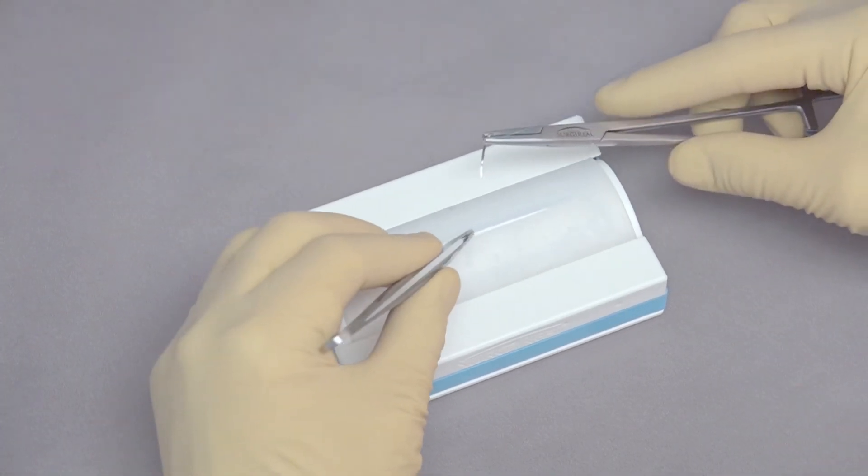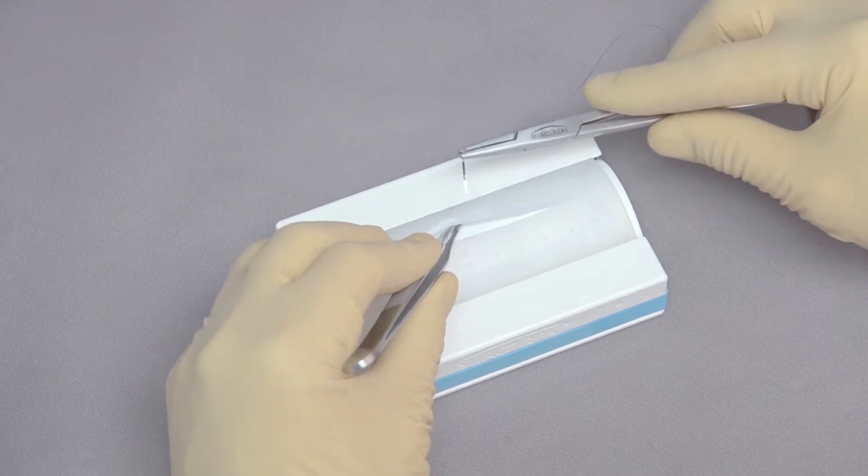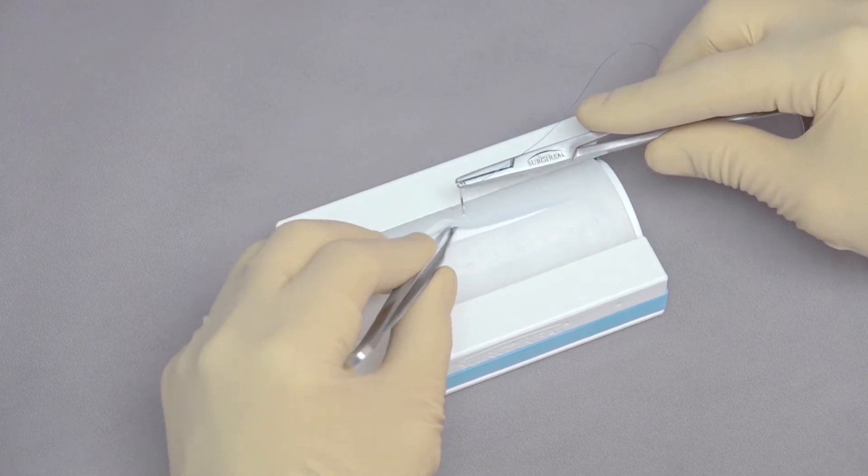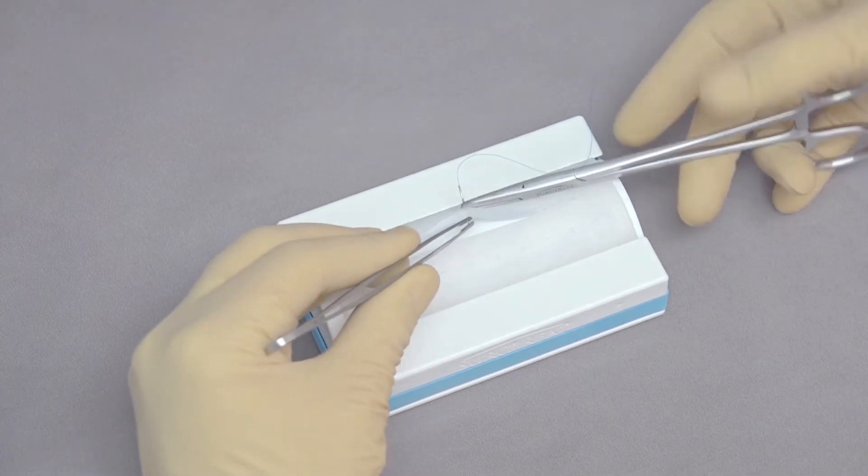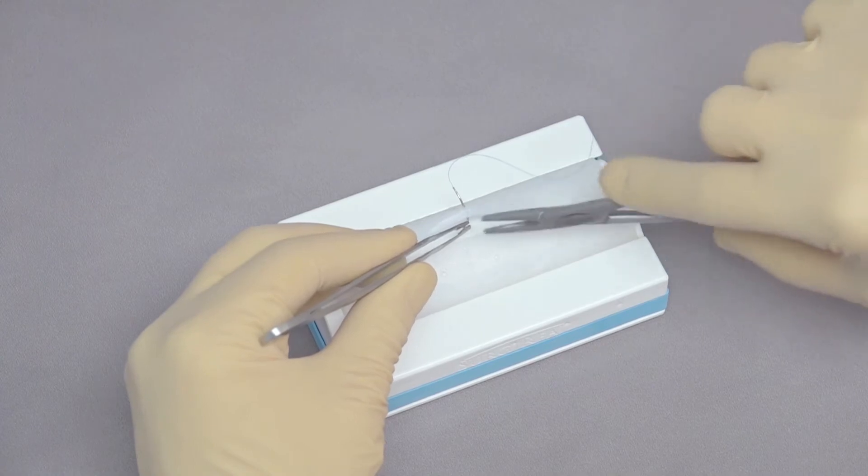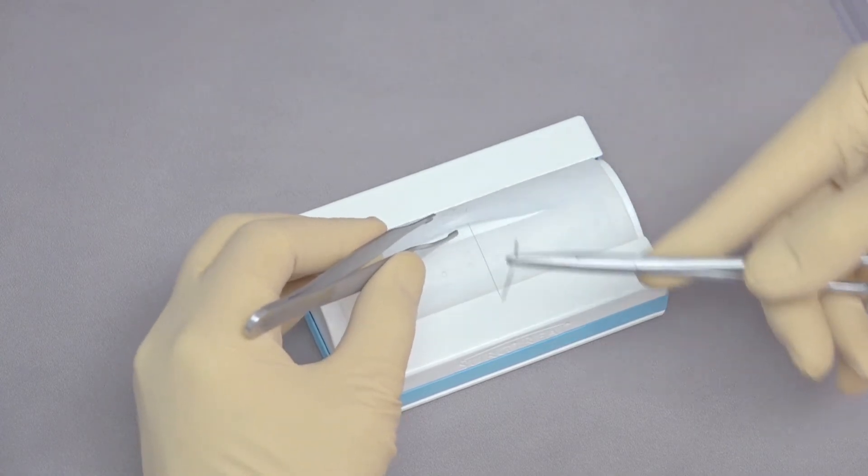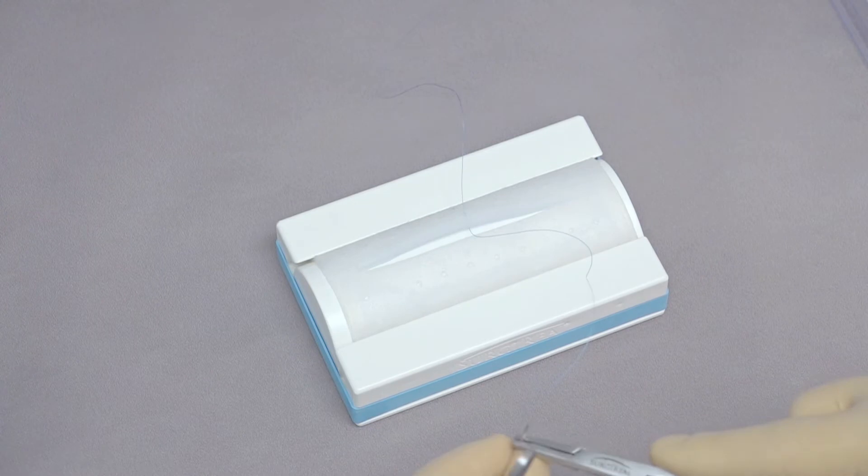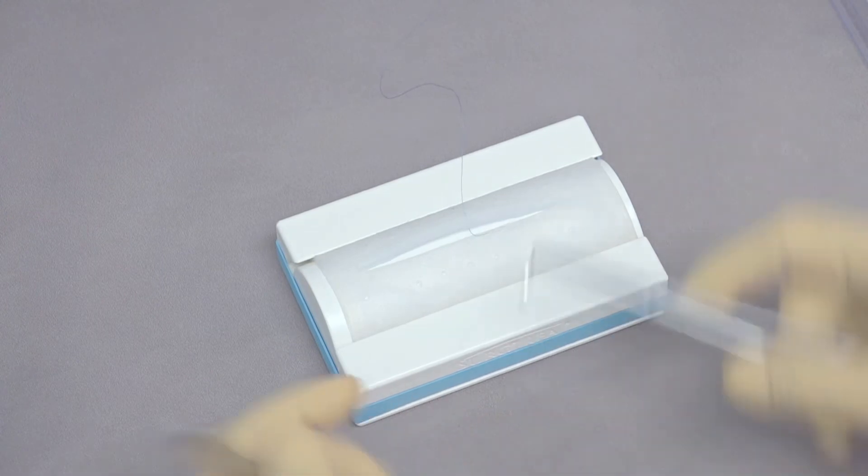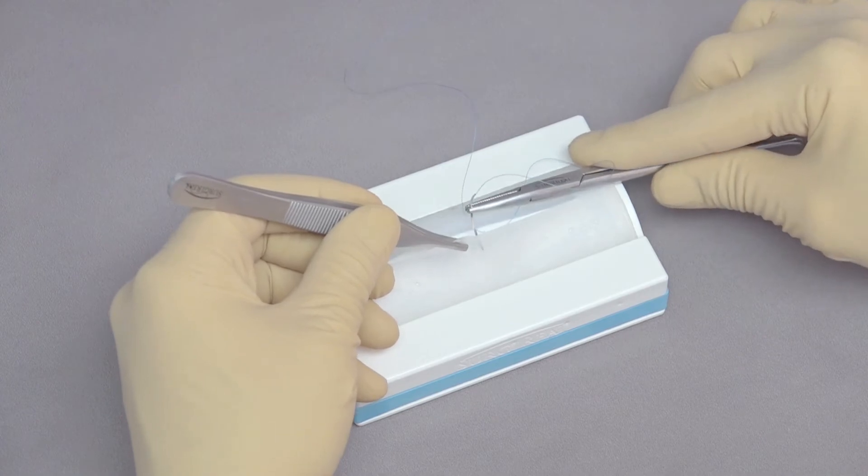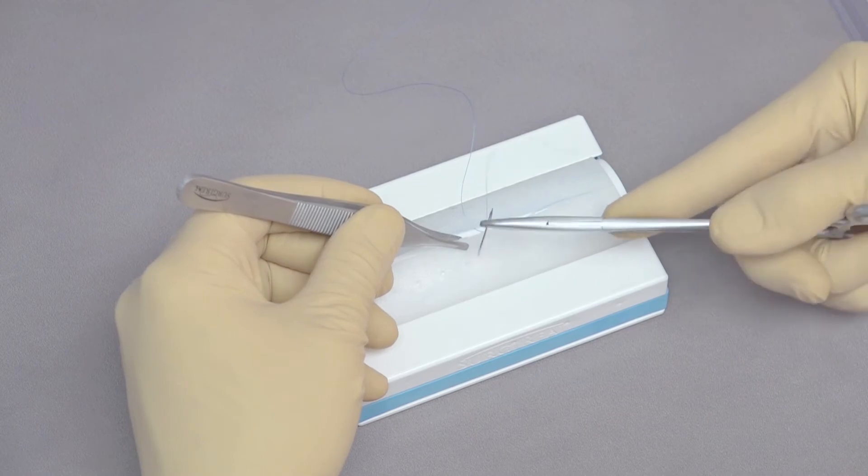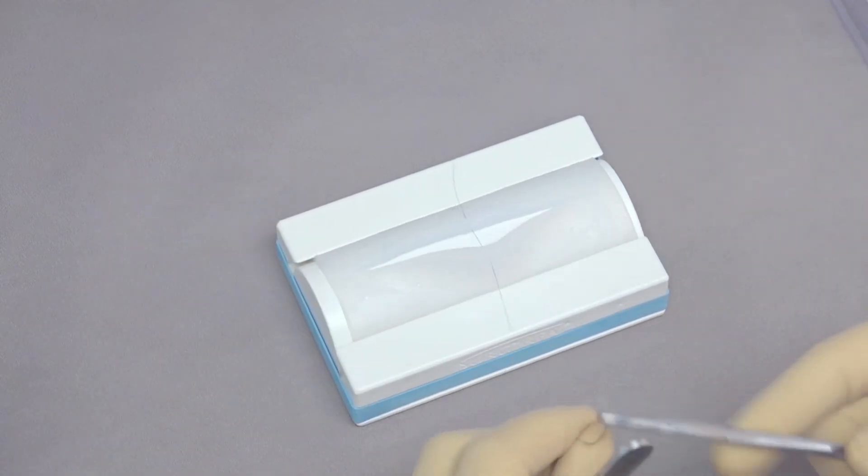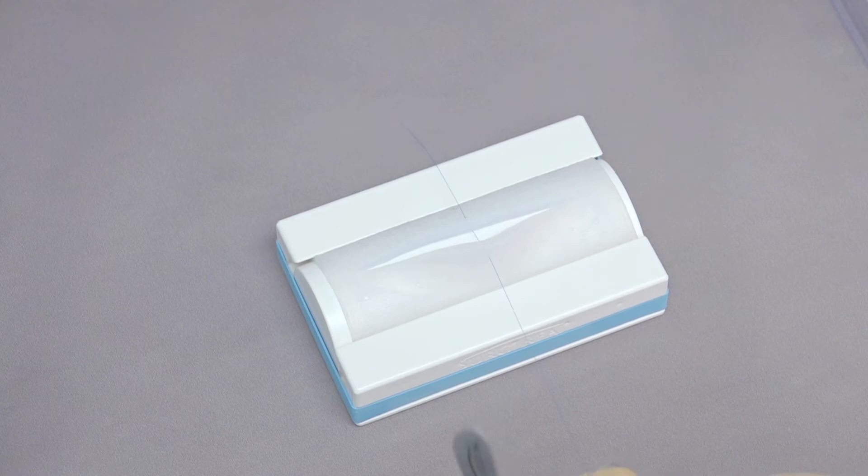Now to place the suture, we're going to go right in the middle of the pad for a simple interrupted suture pattern. We're going to take our first bite about four to five millimeters from the cut edge, stabilize that with the thumb forceps, move our needle holders over using the curve of the needle to bring that through. Reposition the needle, come on the near side, stabilize the tissue about four to five millimeters away from the cut edge, grab the needle, pull that through again using the curve, pull the extra slack out of the suture, and now we're going to do a regular square knot.